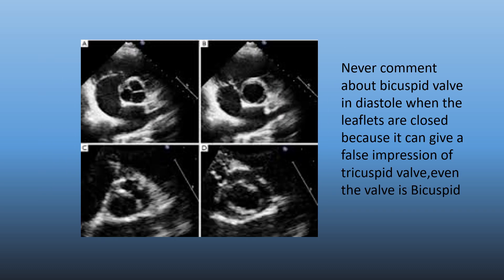Here also, in this short axis view of the aortic valve, when examining in diastole it gives the impression of a tricuspid leaflet. But when we examine it in systole — when the leaflets are open — the actual form of the aortic valve is diagnosed, because here you can find that the aortic valve is bi-leaflet. Similarly, when examining in diastole the leaflets are closed, and the raphe is giving a false impression of a tricuspid leaflet, though the valve is actually a bi-leaflet valve.